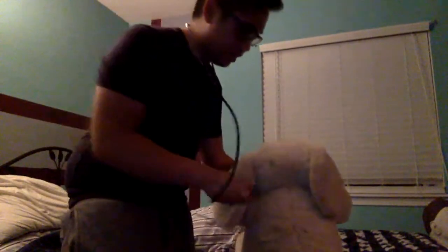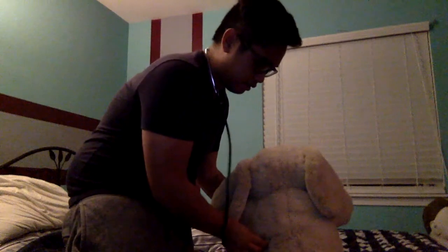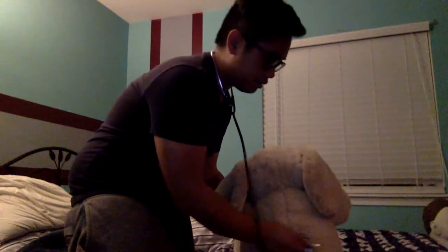And then on my back, I can actually show this on the teddy bear. The back would be here, here, here, here, here, and here. All of that would be done with the wider end of the stethoscope, the diaphragm.